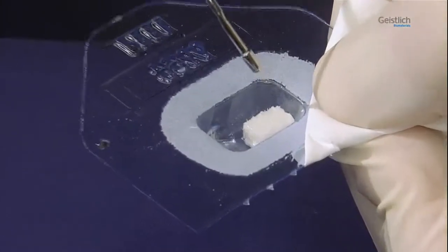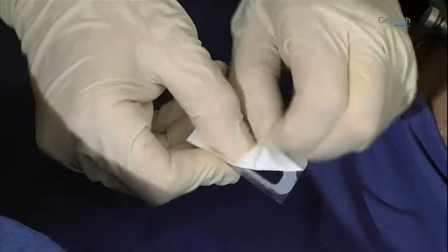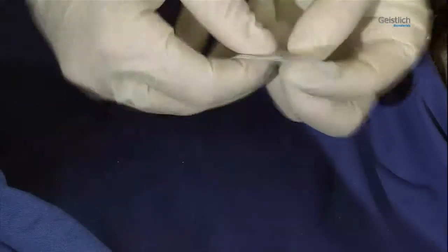The Geistlich Bio-Oss Collagen block absorbs liquids well. Once we have removed the membrane from its packaging, the paper of the blister pack can be used as a template to determine the proper size and shape for the membrane before working on the actual membrane.